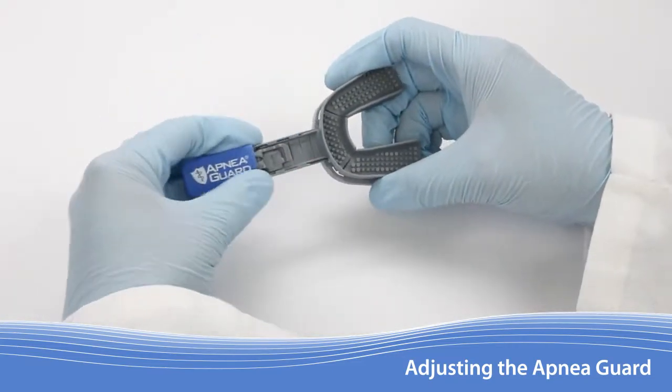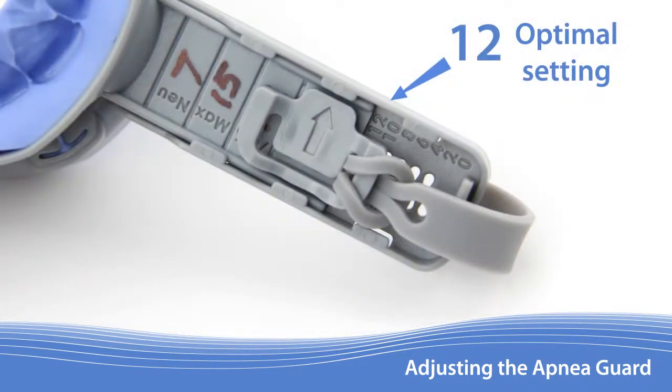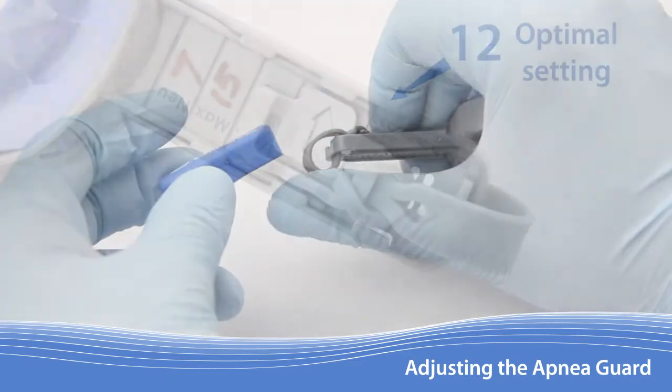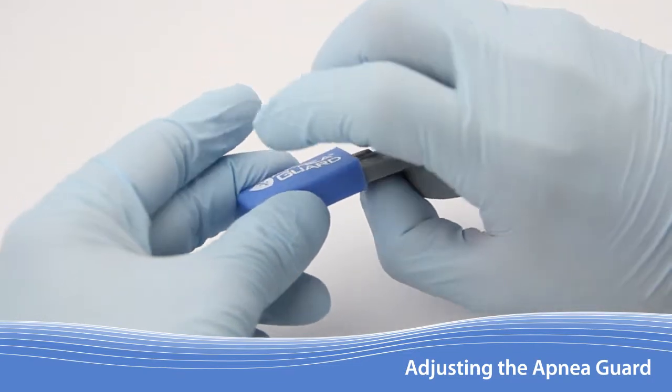Consider teaching the patient how to remove the handle cover and lock and read the adjustment setting. Refer them to the optimal setting that is written on the handle. Once an acceptable advancement setting is achieved, tuck the lock tether under and push the cover over the handle.